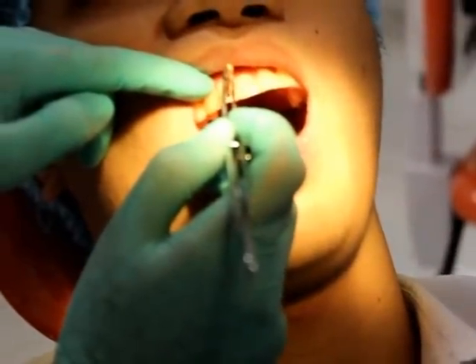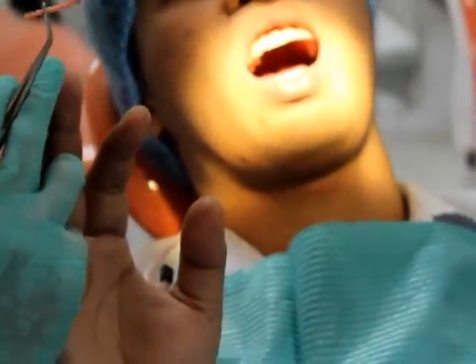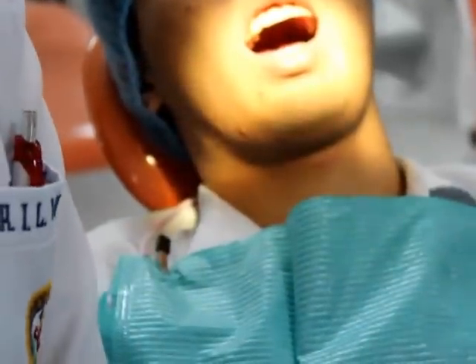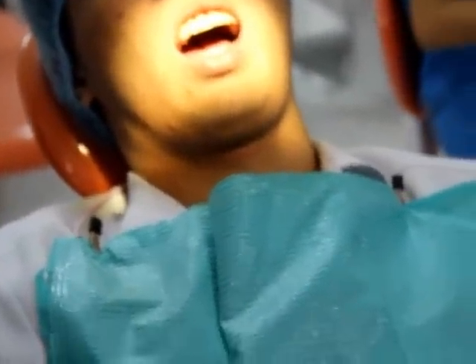Can you feel? Okay, what is the instruction again? Once you feel something, raise your right hand. Once you don't feel anything, you put it back. Okay. You have to get 2 timings, and then tell me the interpretation. Let's start.